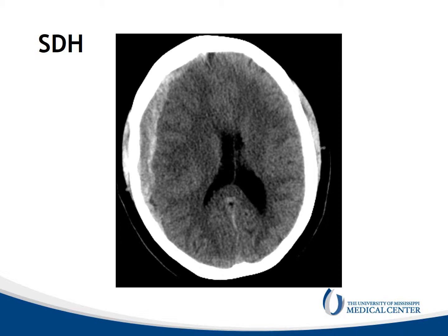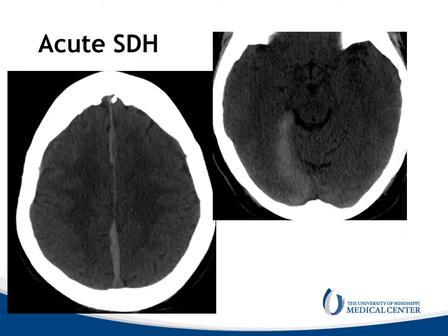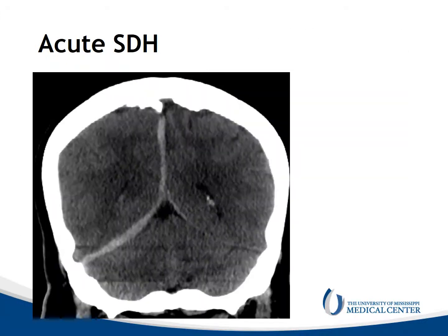This is a subdural hematoma. We can see that there is a right whole-hemispheric crescent-shaped hyperdense collection, and it is causing midline shift and mass effect. Here is another acute subdural hematoma. Again, we can see that it's along the right aspect of the falx and the right tentorium, and it does not cross the tentorium or the falx.